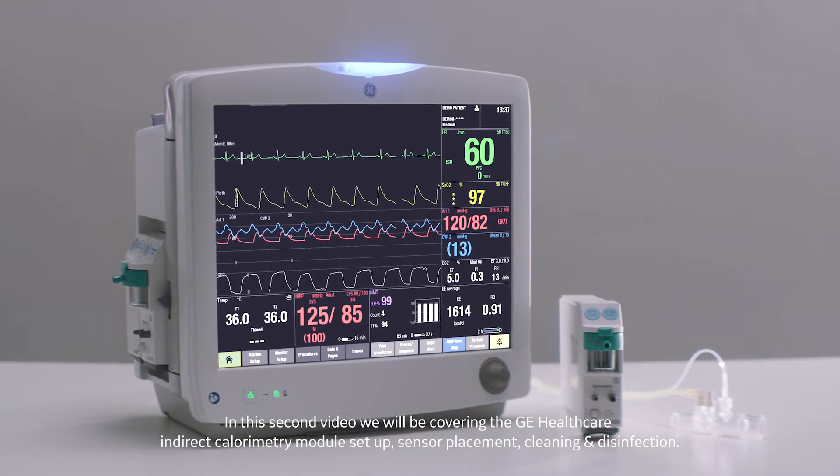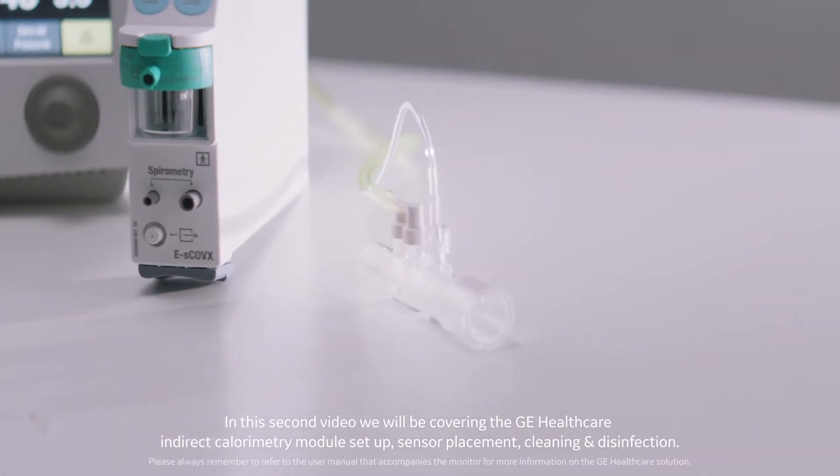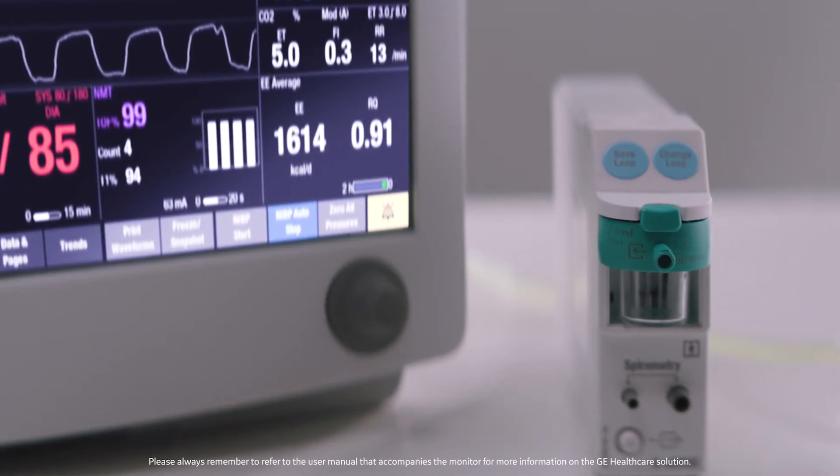In this second video, we will be covering the GE Healthcare Indirect Calorimetry Module Setup, Sensor Placement, Cleaning, and Disinfection. Let's get started.